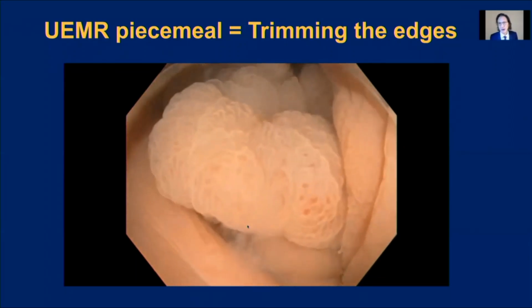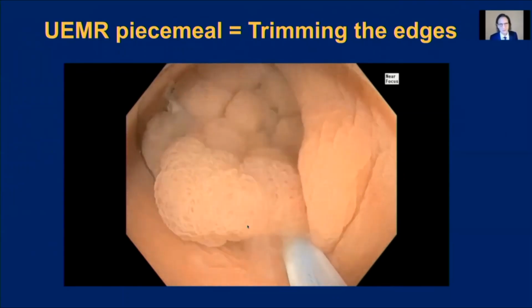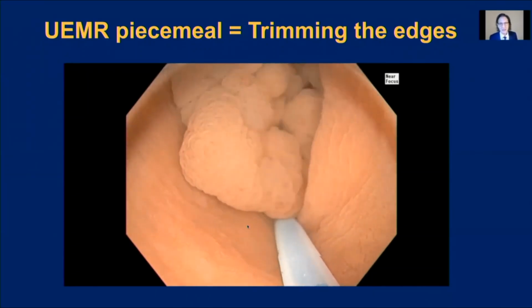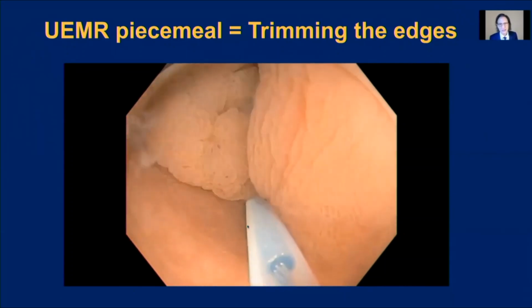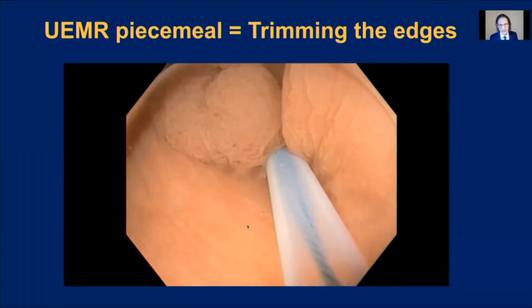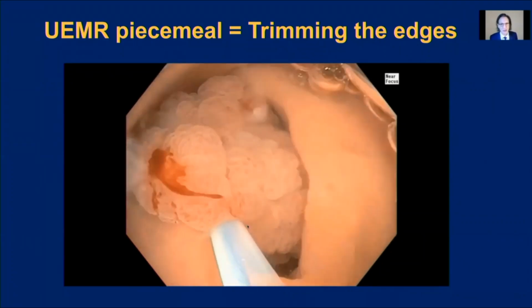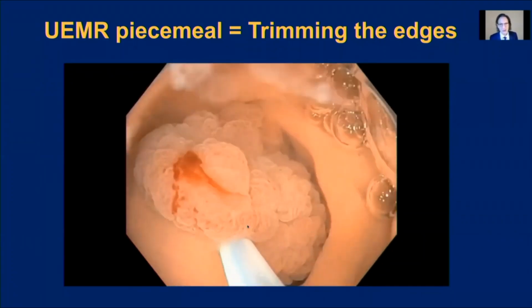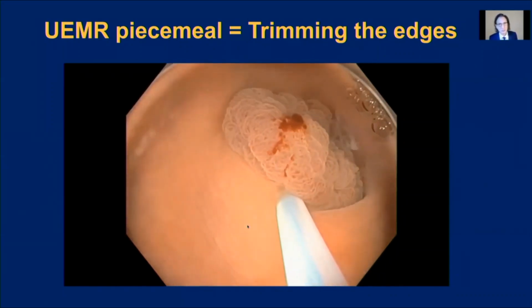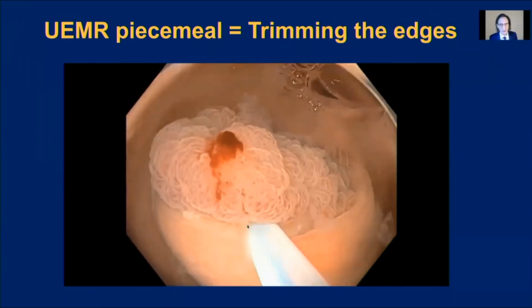And now with the torque and crimping, to and fro movements, so various maneuvers we use to maximize the displacement, the shift of the lesion into the snare lumen, and we close the snare, and we'll see some discoloration. Of course, it turns violaceous as we close our snare. We can rotate a bit just to assess whether we have captured at least most of the lesion. And then we apply our cutting current.